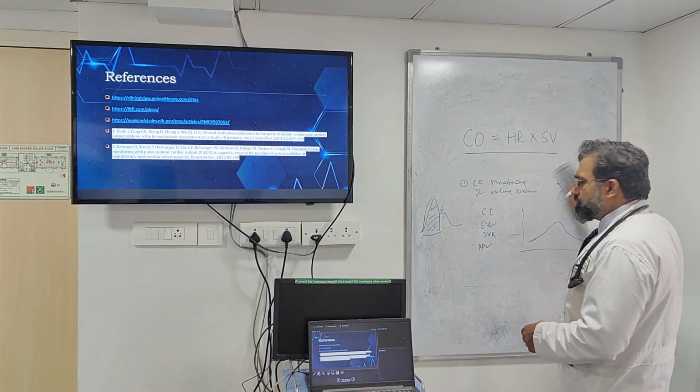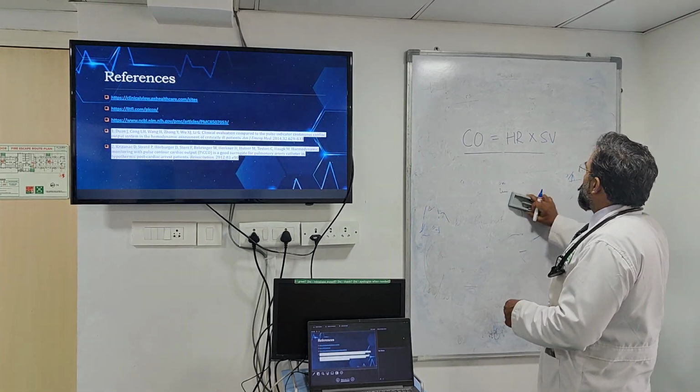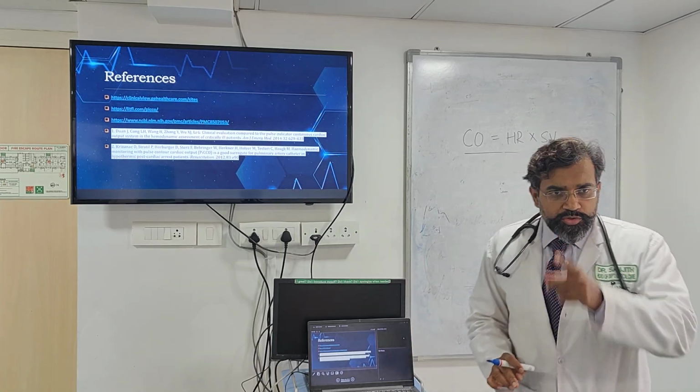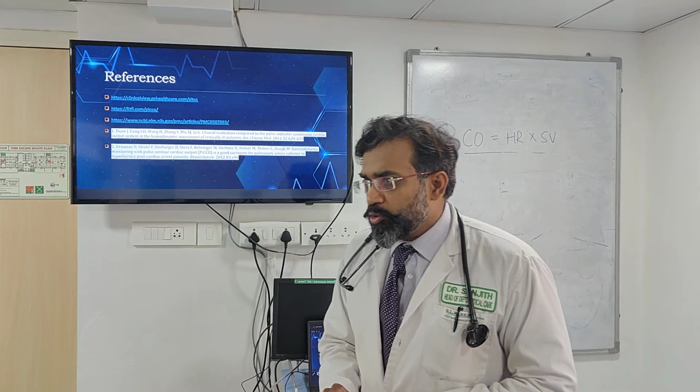It's the other way around, so don't make this mistake in the exam. In exams, this question may be asked: what is cardiac output? Cardiac index is the other way around. The BSA. So, Pulsion is the entire device. Picco is the entire device.